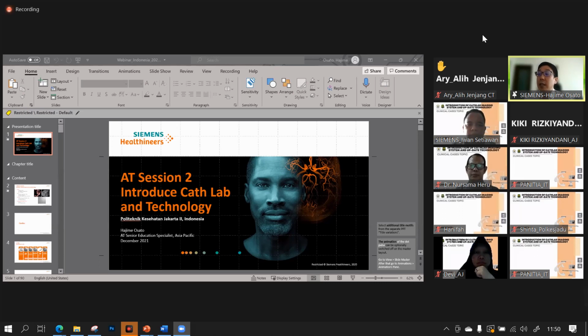That's why they use an FFR device instead of QCA. Still, QCA is mainly used in Japan.